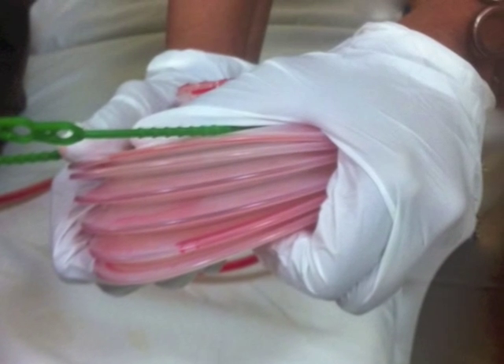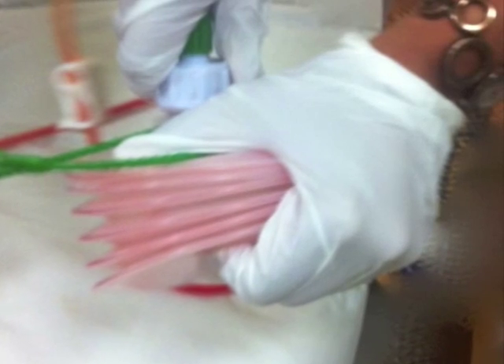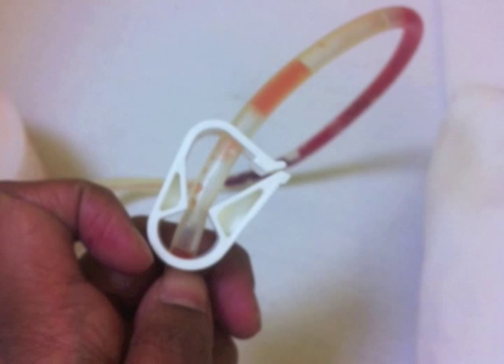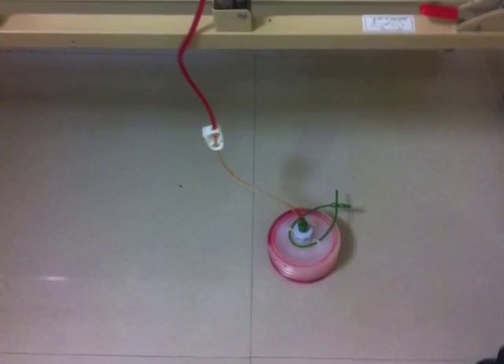To charge the drain, the canister needs to be compressed. It is held in compression with one hand while the other hand screws on the tubing connector by rotation in a clockwise manner. Ensure that the clamp is opened, the canister is in a compressed position, and there are no kinks or clots in the system.